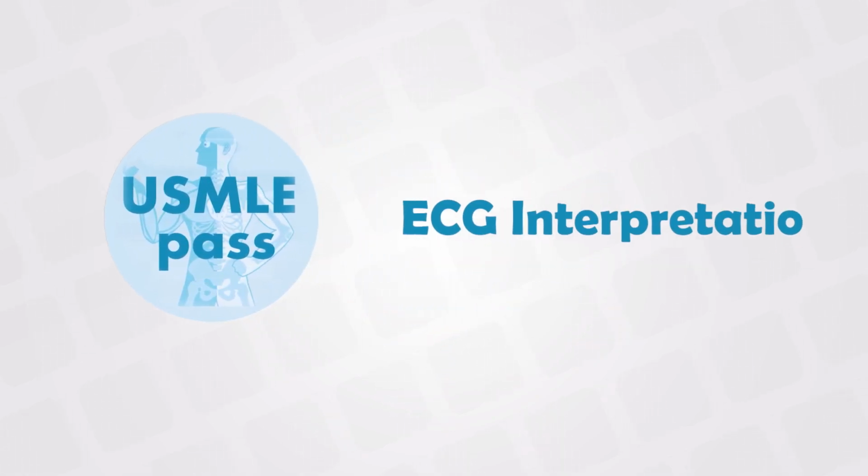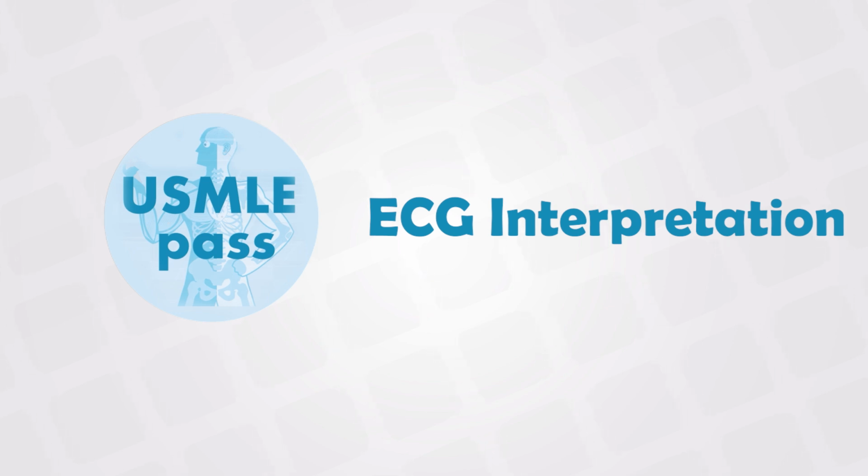Welcome back. In this video, I'll teach you how to read the ECG effectively.